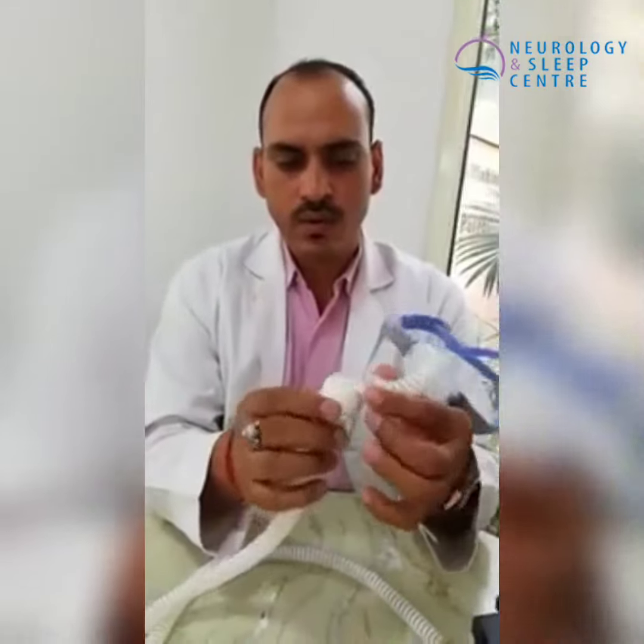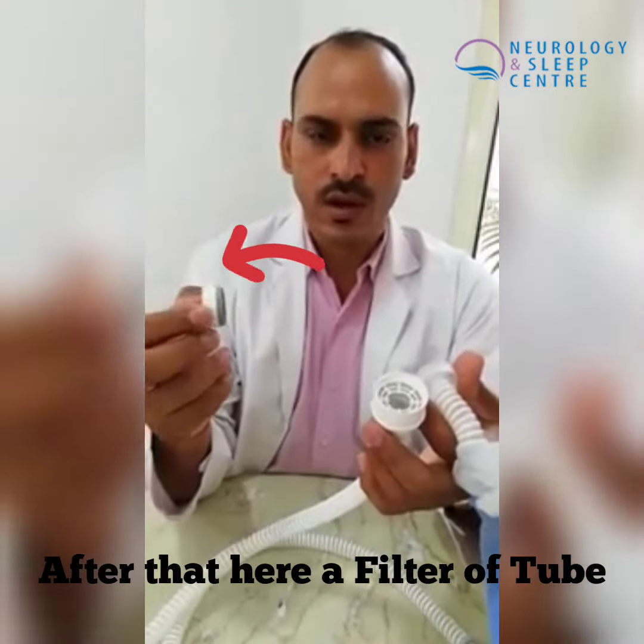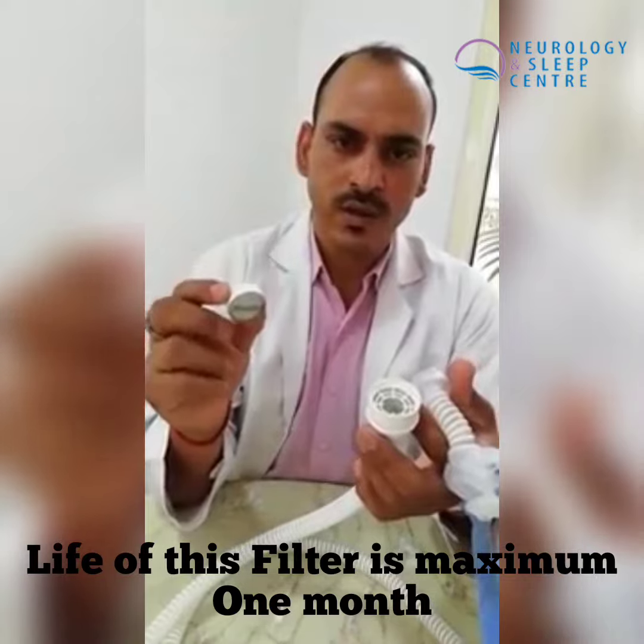The next component is the HumidX filter. It can cause dryness if not maintained. It needs to be used for a month, and after a month it should be replaced.